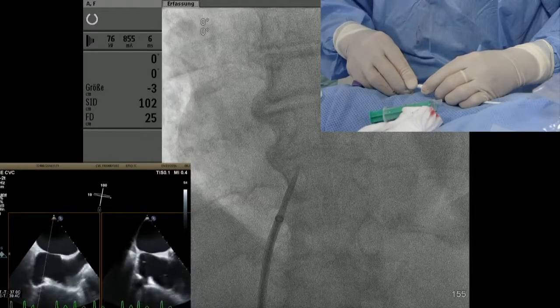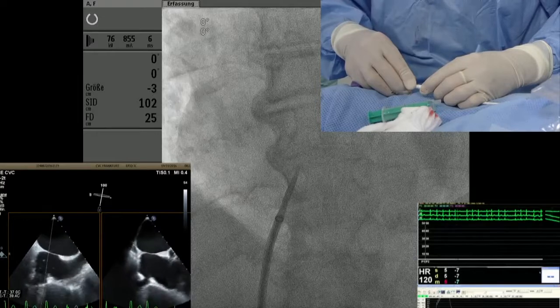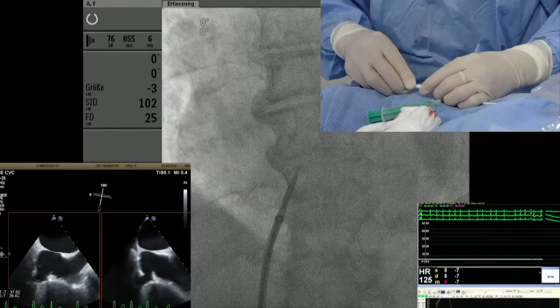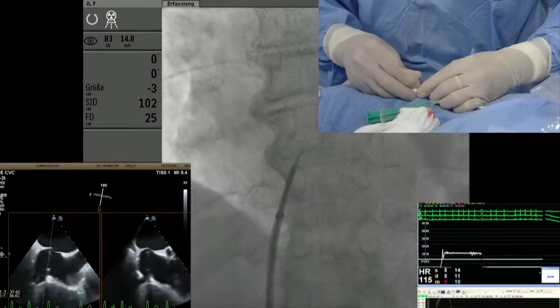So are you satisfied with the puncture location, Peter? Yeah. Don't say later on, Peter, that's not a good position, as you usually do. Matt, are you happy? Right now I don't see it. Looks fine to me. Okay, so I will puncture the Californian mat, as opposed to the Oxford mat, or both. We'll move.